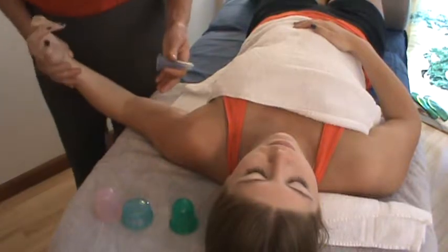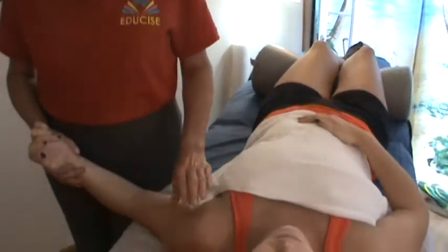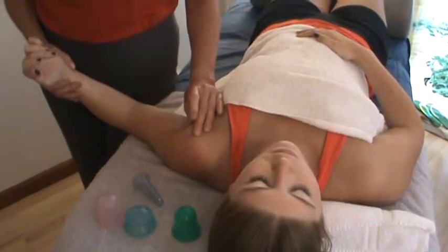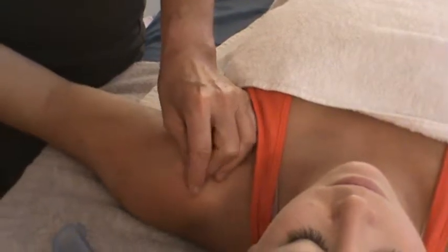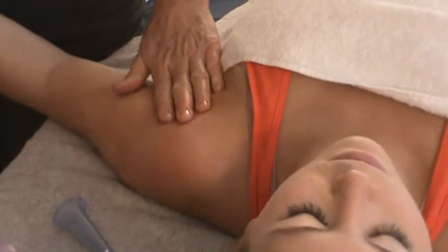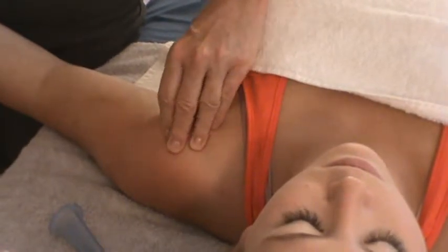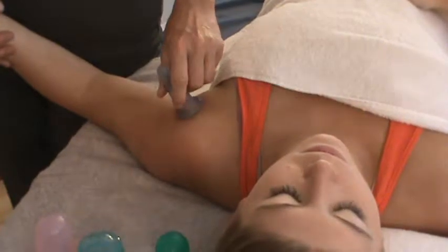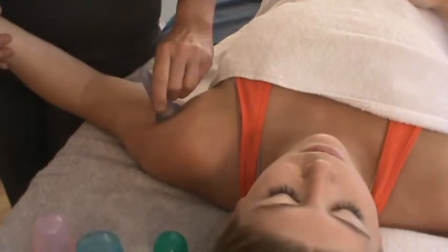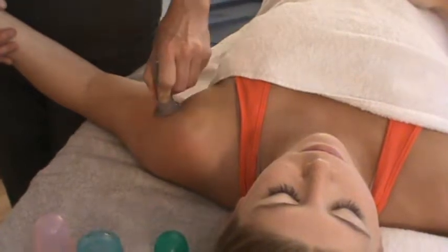For someone who's very stiff, and especially if the skin is very adherent over the front of the shoulder, you can do some skin rolling to see if it's adherent. And on our model here it's not, but in patients you'll often find that the gliding and the rolling is very difficult to accomplish here, and that's where you want to break out the cups so you can have a better grip. Also, pre-lubricating the tissue ahead of using the cups makes it easier for you to get a purchase on the cup, otherwise they tend to get very slippery.